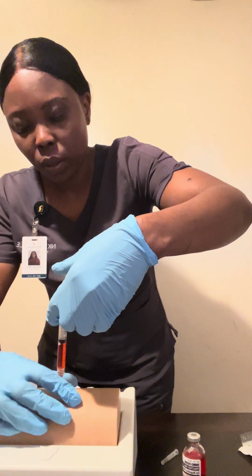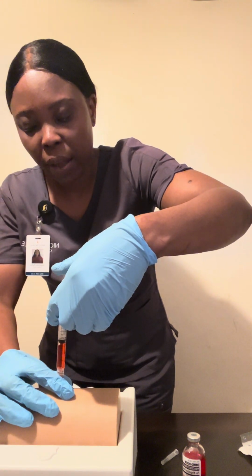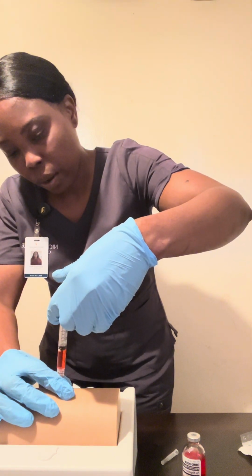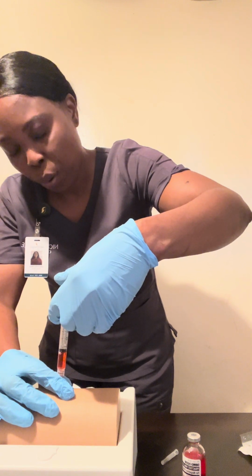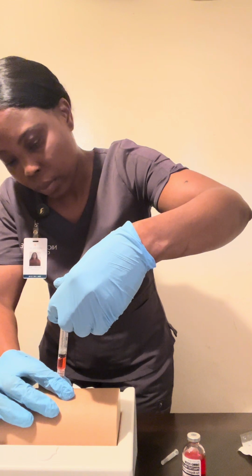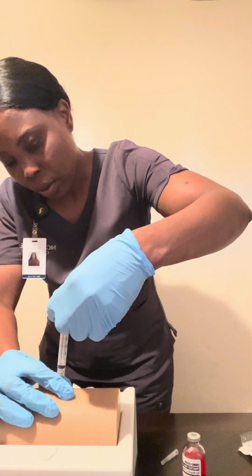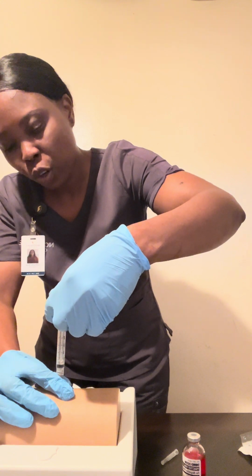I'm gonna support the needle with my finger, and then I'm gonna inject the medication slowly, about 10 seconds per ml. And then I'm gonna hold it about 10 seconds before I withdraw the needle.